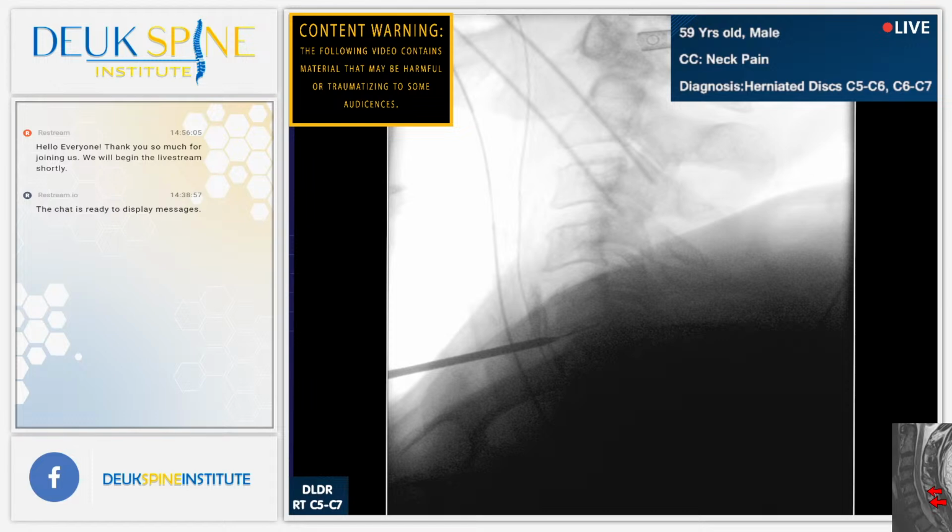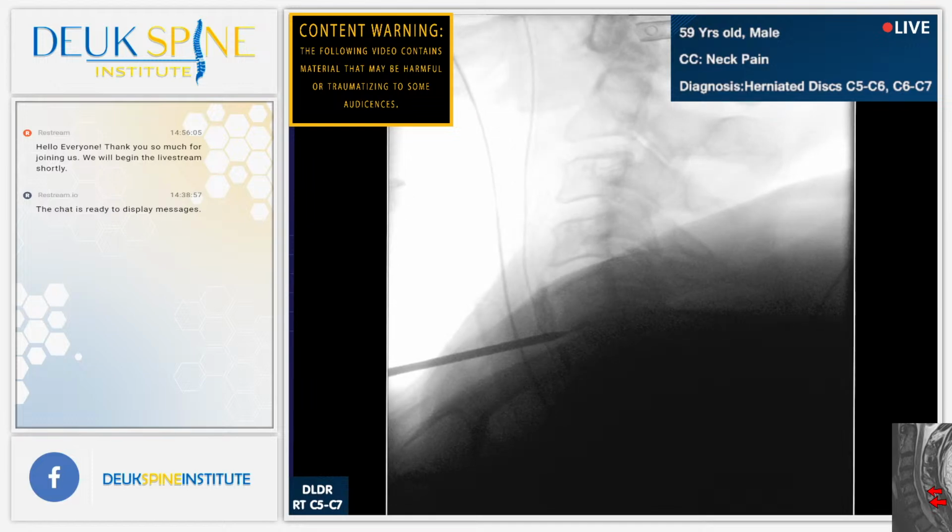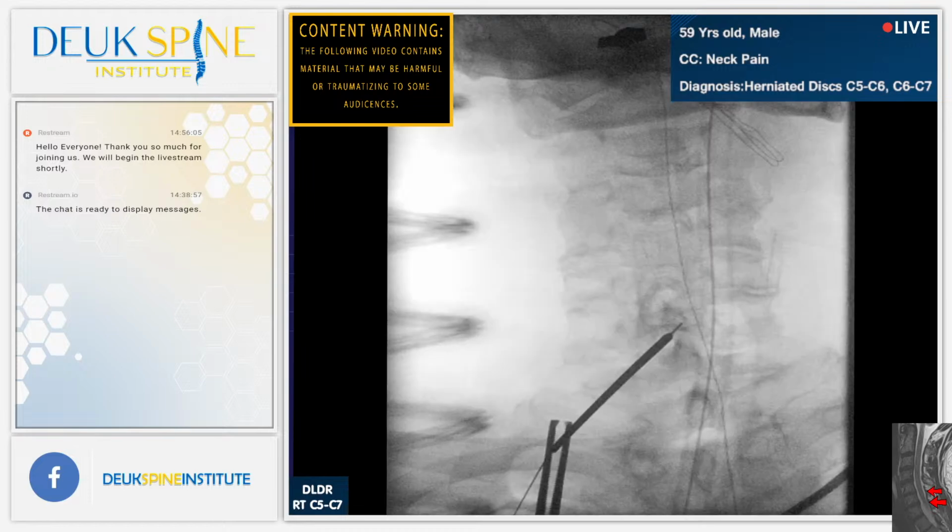All right, I'm at the front of the disc, front of the spine. And let's get an AP, make sure we're in the middle. Coker. AP, for those of you who don't know, is an anterior posterior view, front back. We've been doing side views. Let's get a front back. Oh, perfect. Look where the tip of that probe is. It's dead center. Right there, yeah. And the guide wire runs off to the left a little bit. All right, thank you. Back to a lateral view.